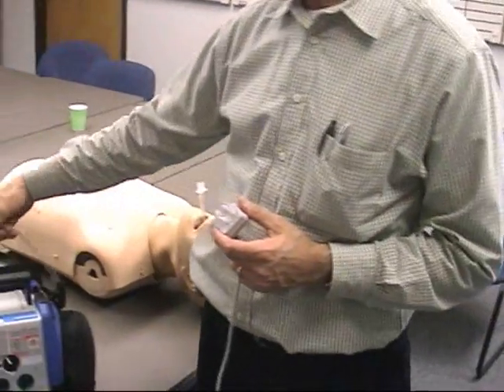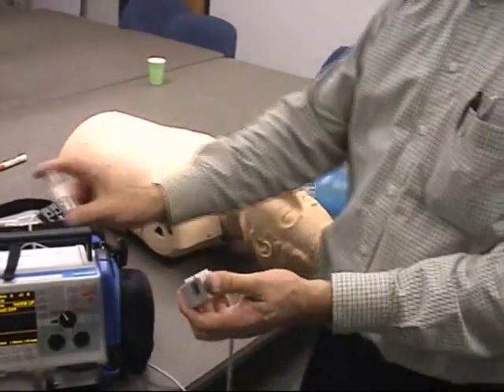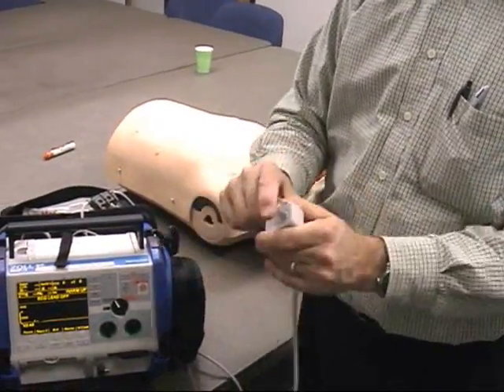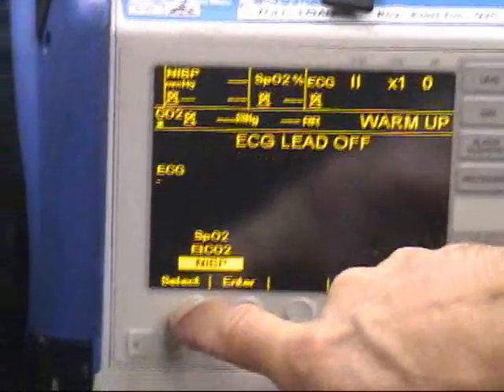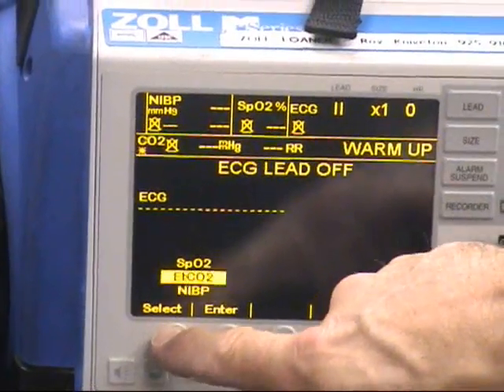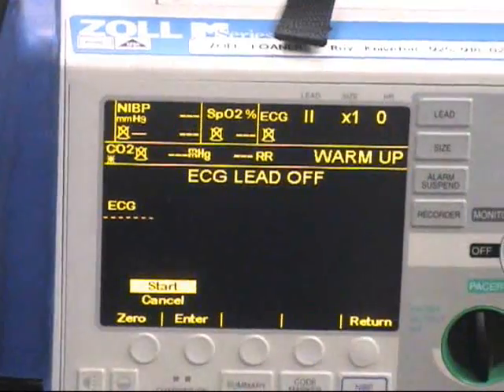We no longer use the gray reference cells. What we do is put the clear airway adapter in the sensor, go to the screen, press the parameter button, then scroll up to end-tidal CO2, press enter, and then press zero.